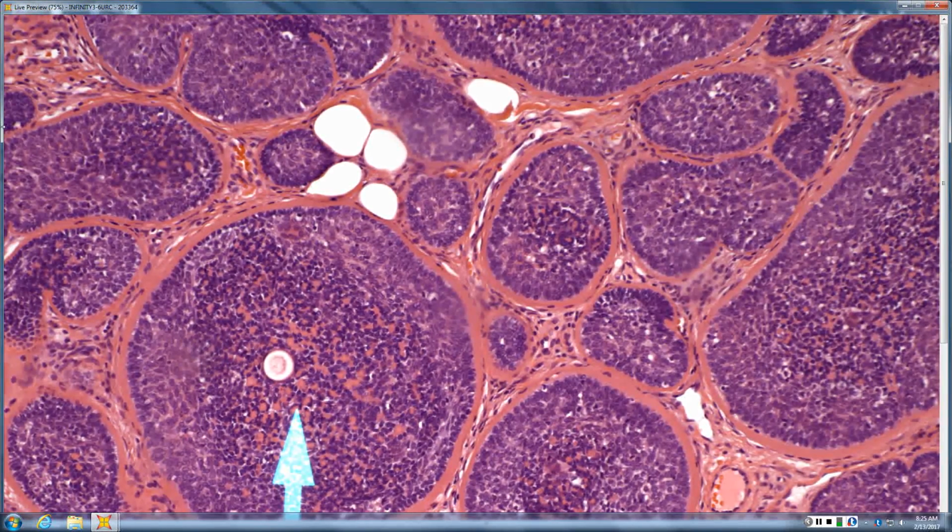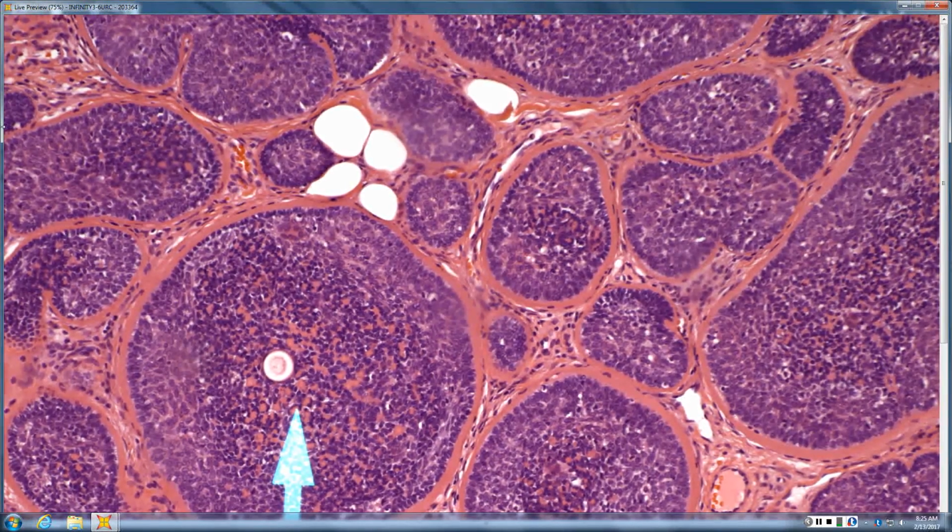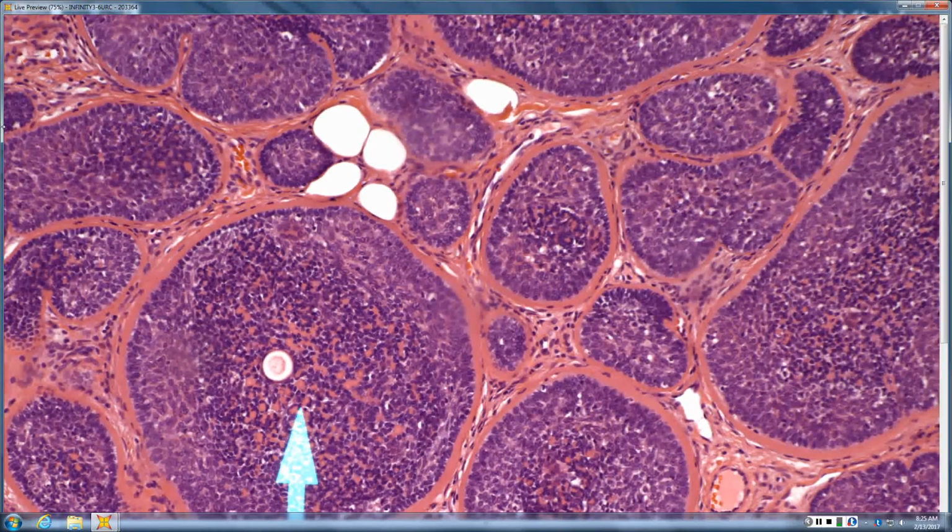The cylindroma is more jigsaw puzzle, less inflamed. The spiroadenoma is bigger blue balls, more inflamed and therefore tender. Remember that you can get little droplets of the basal membrane zone within the tumor as well as the thick basal membrane zone material at the periphery. Very good.